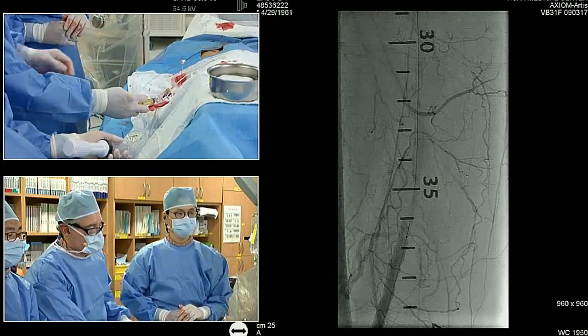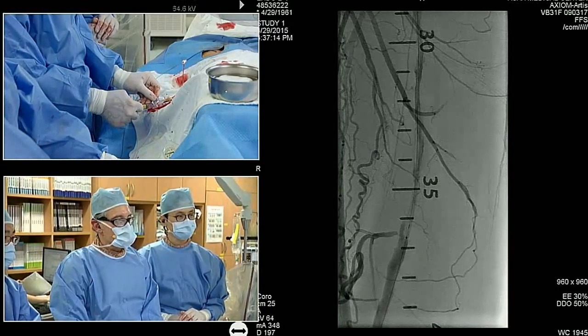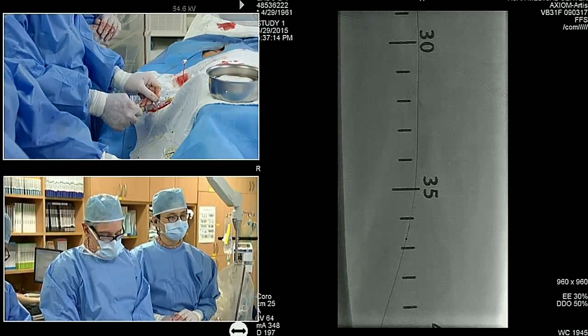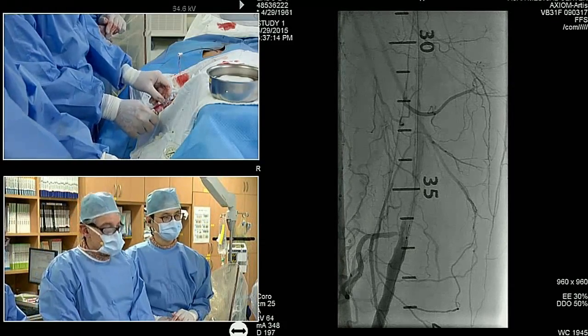So this would suggest, and I believe this was the case, that I was subintimal at times, and then I re-entered right at the distal cap. Maybe I'm true lumen all the way, but I doubt it. I would vote to stent this in some form or fashion. Yeah.